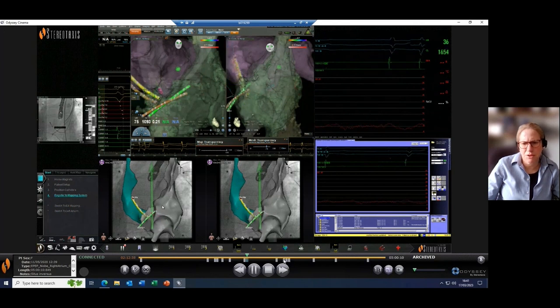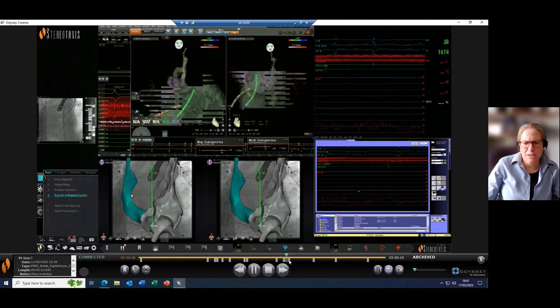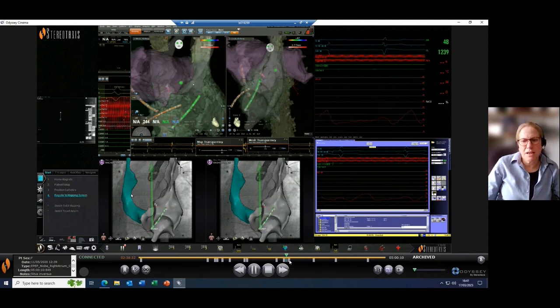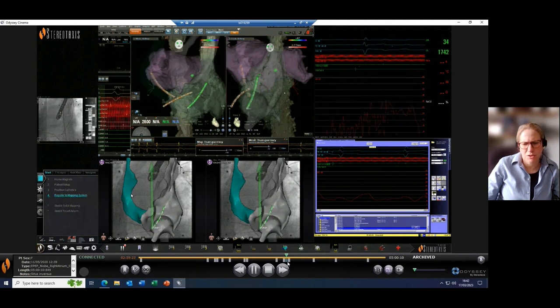So I'm going to jump forward possibly to this scene and show you that we eventually managed to get in. Quite difficult to get to the right place and do a safe transseptal puncture. Again, you see here the needle, and then eventually the needle will go in. Massively turning, this is a steerable sheath, which is far too long. I didn't have access here to the short Agilis sheath. So eventually we get the sheath and the needle. You'll see that it's agonizing to watch it even on the X-ray, pushing the sheath in. Now it's in, and that was the transjugular transseptal.